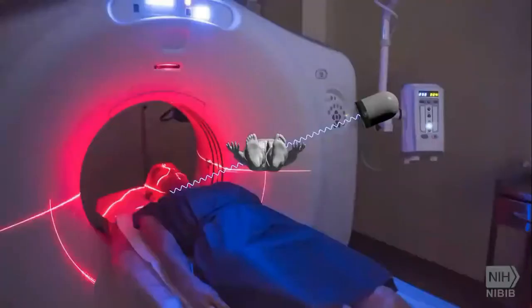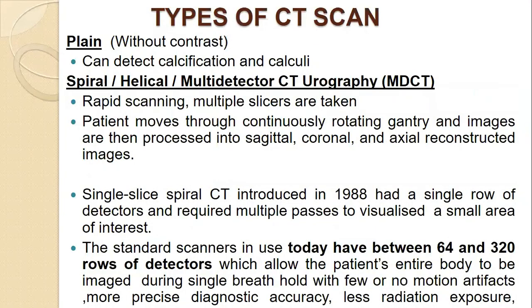So these are the CT machines. Anyone, what are the types of CT scan available at SIUT? Most of the time we are doing this. We are using different CTs over there.